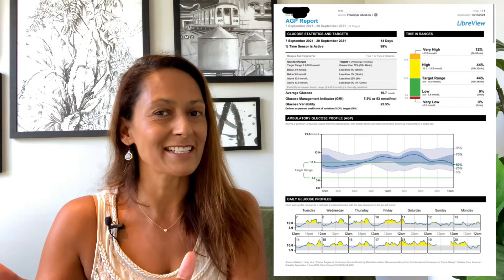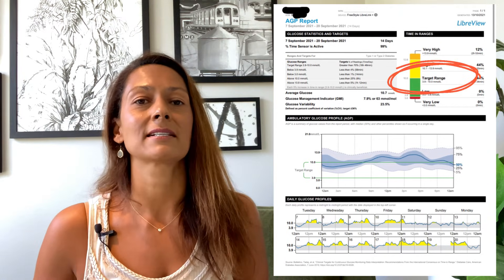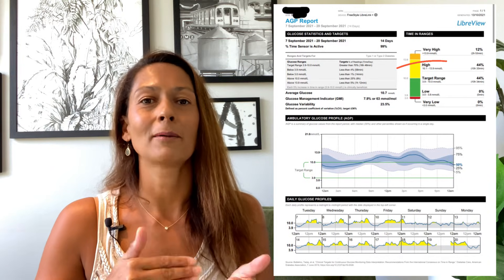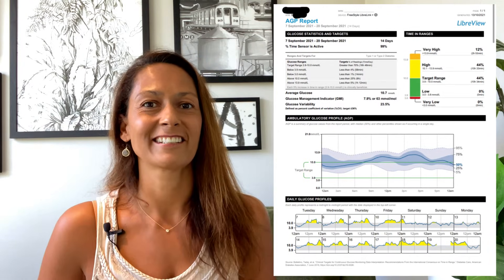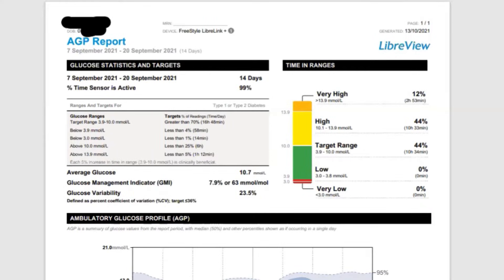Millimoles per liter is used widely outside of the US. If you're in the US you're using milligrams per deciliter — to convert from mmol/L to mg/dL you multiply by 18. So the target range of 3.9 to 10 mmol/L is equivalent to 70 to 180 mg/dL. On the left-hand side of the AGP report you can see the date range, the percent of time the sensor is active, and the glucose ranges. The target range is highlighted in gray.